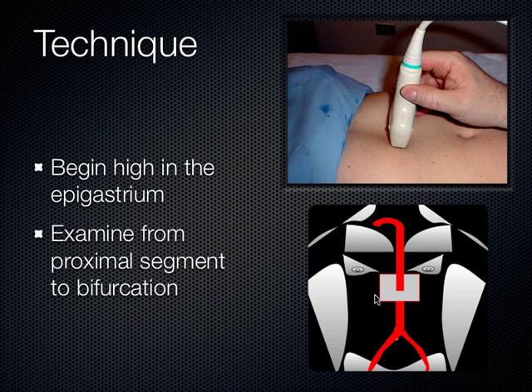By the way, these are nipples. This is my trying to wait it. It's not eyes. Everybody thinks those are eyes. Not eyes. We're not doing this on the face. This is my terrible drawing here. If anybody can draw, let me know, and you're more than happy to take your drawings.